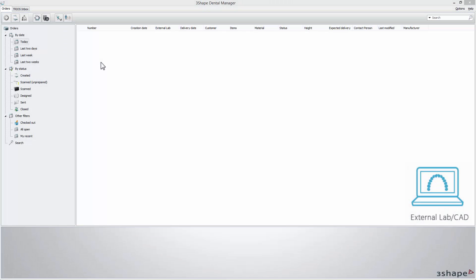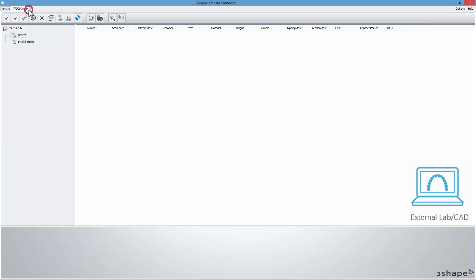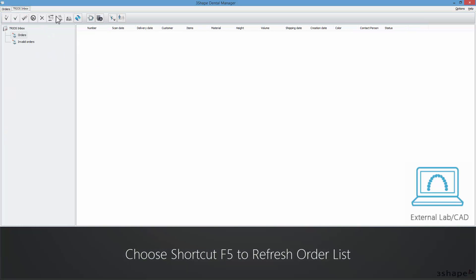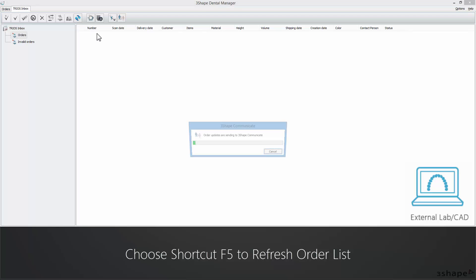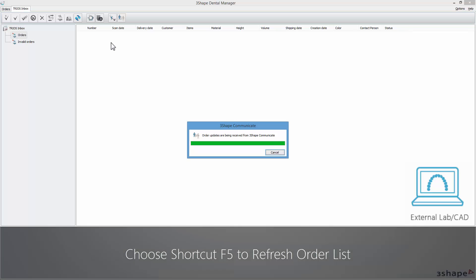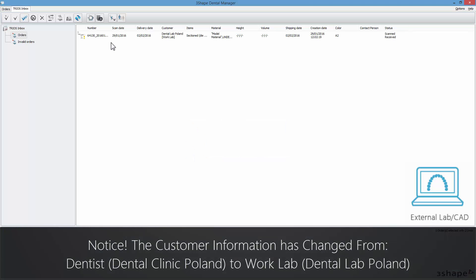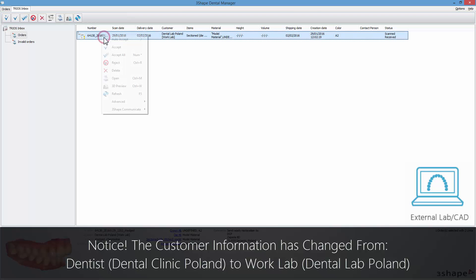As an external lab, whenever you want to check if you have received new orders from other labs, you can either click on the Refresh button in the TRIOS Inbox tab or choose the F5 shortcut on your keyboard. A received order will appear in the TRIOS Inbox. Accept it.